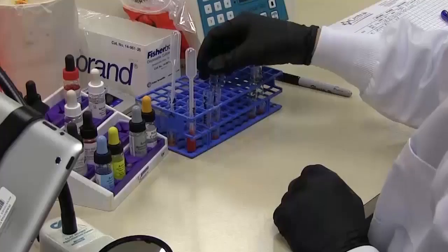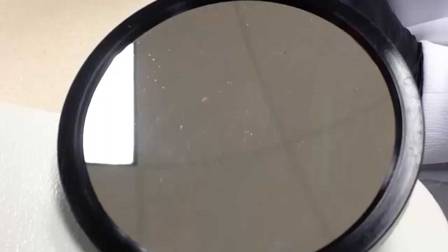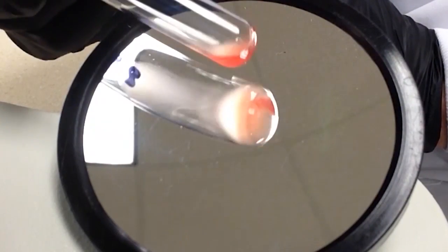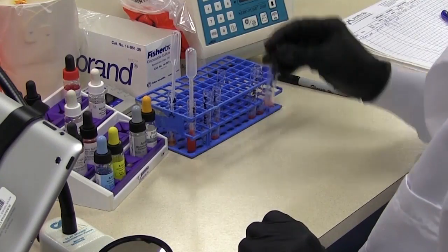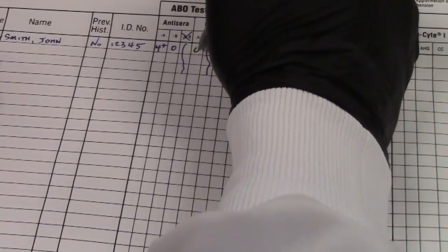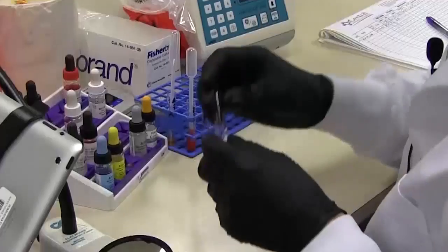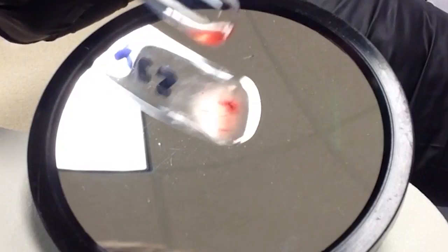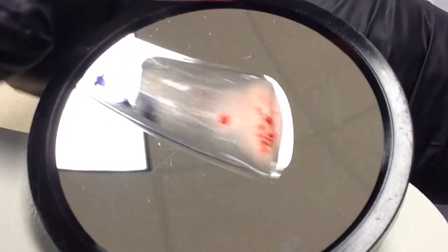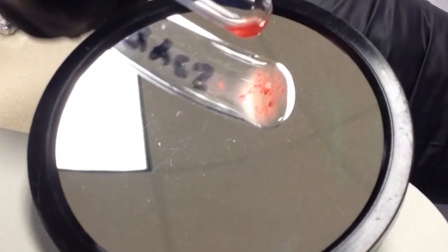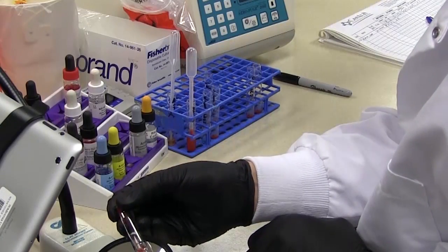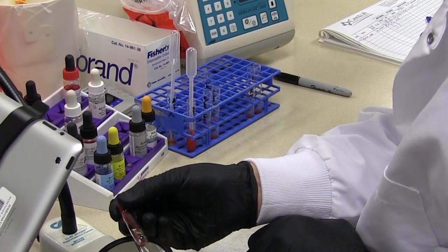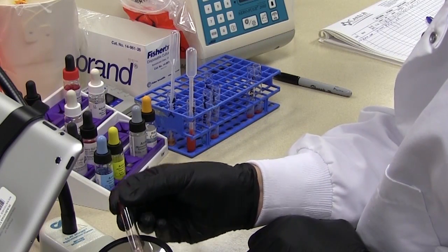All right let's go ahead and do our reverse typing. So here we have the A1 cells. Okay again smooth cell suspension. So A1 here with the cells is negative. Okay our last tube our B. Okay so now this is certainly not a four plus reaction here. I see some small chunks here as well as some larger ones and a pretty clear background. So we're going to call that a two plus.